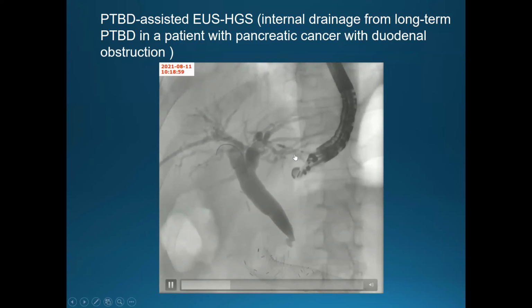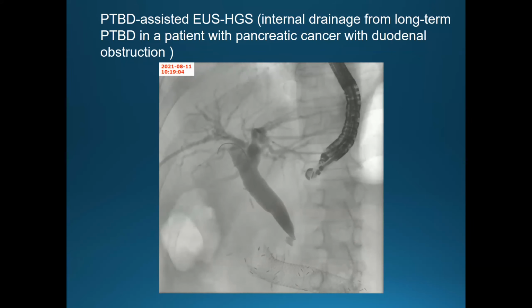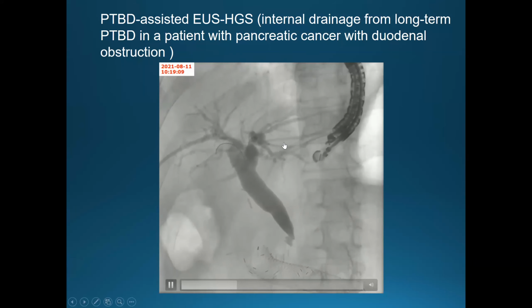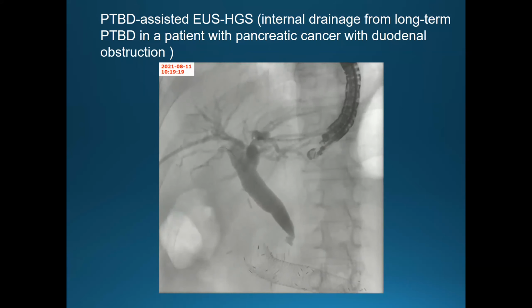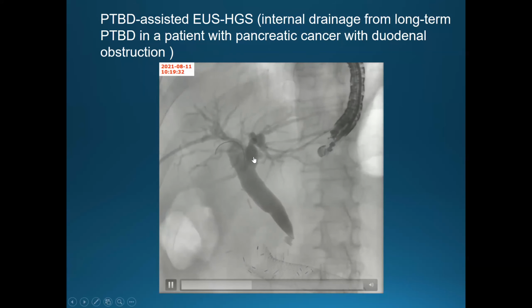This patient was a little bit difficult for the puncture. At the time, we needed some muscle. Then successfully, we achieved one-step deployment of the HGS stent without dilation. There is some problem with deployment inside the metal stent. Sometimes we have to-and-fro movement, and the stent is slightly deployed inside the metal stent. Then the stent may go through into the proximal bile duct sometimes.